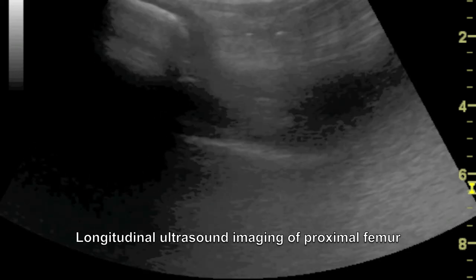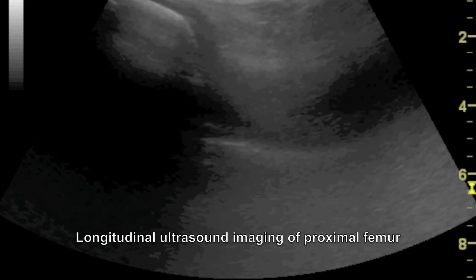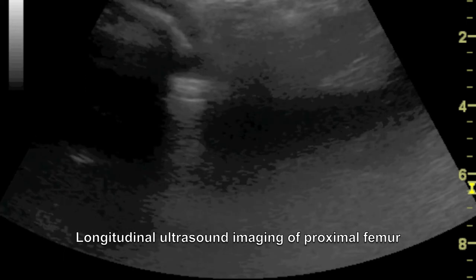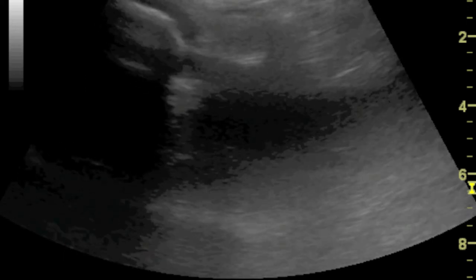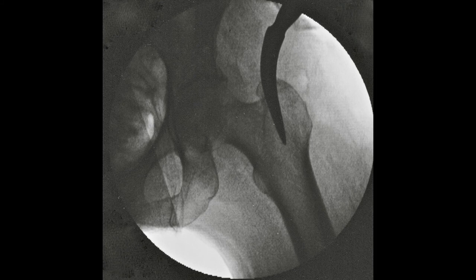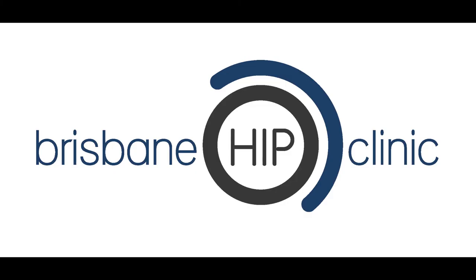The combined use of intraoperative ultrasound and fluoroscopy are able to guide the skin incision and the initial placement of instrumentation such as an awl or guide wire that are used for the initial development of the femoral entry point. I hope you find this technique of use.